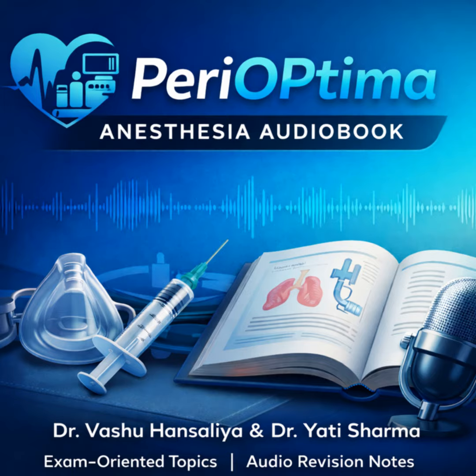Now, confirming the endotracheal tube, this is a bit of a controversial one, isn't it? It's a Viva trap. I know you know this one. The 2020 ICU protocols make it crystal clear. Ultrasound is an adjunct. It does not replace capnography. Right. Capnography is the gold standard. But what if I'm in cardiac arrest and there's no cardiac output? The capnograph might be flat even if the tube is in the right place.